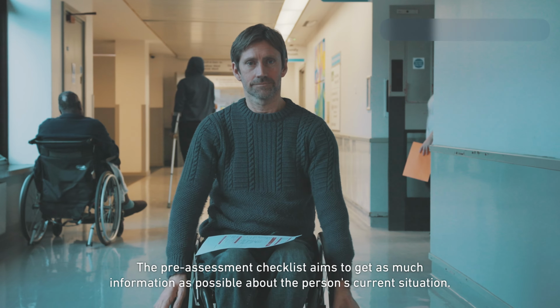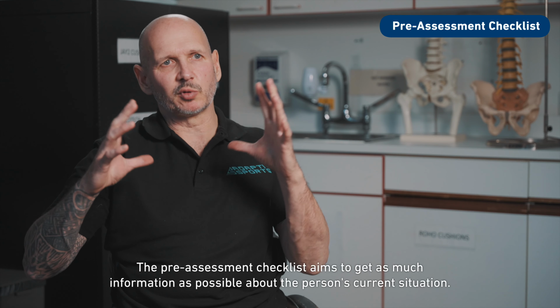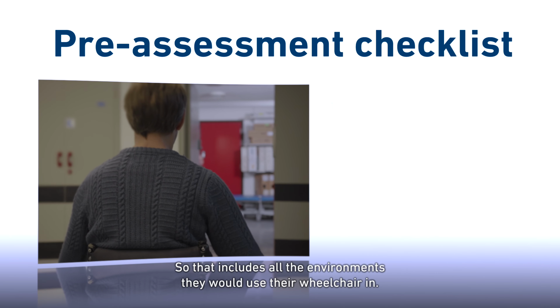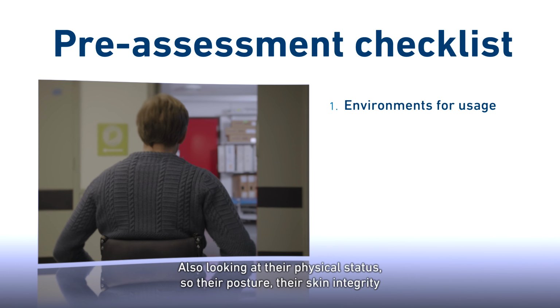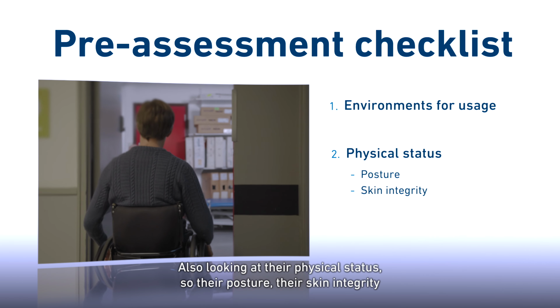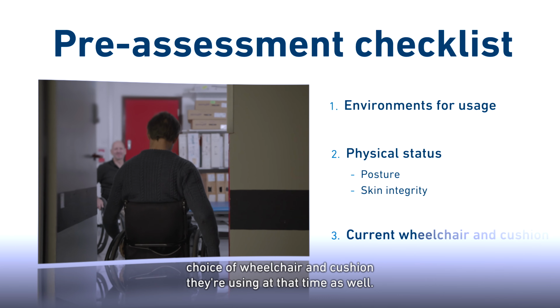The pre-assessment checklist aims to get as much information as possible about the person's current situation. So that includes all the environments they would use their wheelchair in, also looking at their physical status, so their posture, their skin integrity, choice of wheelchair and cushion they're using at that time as well.